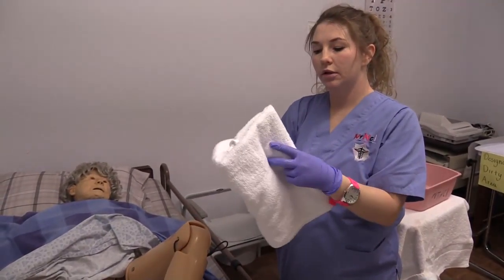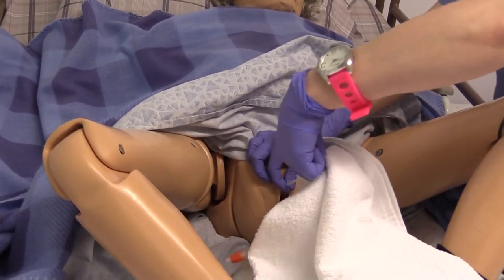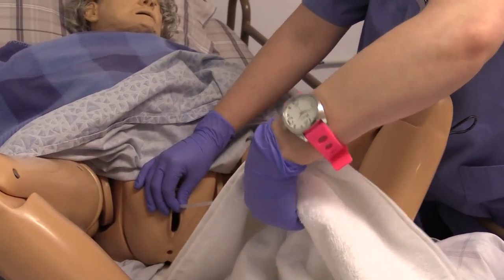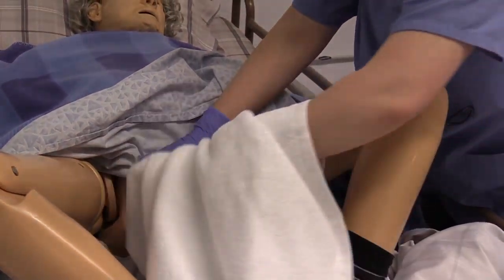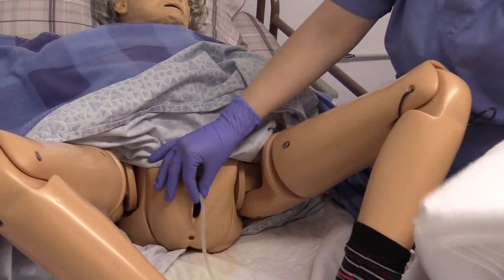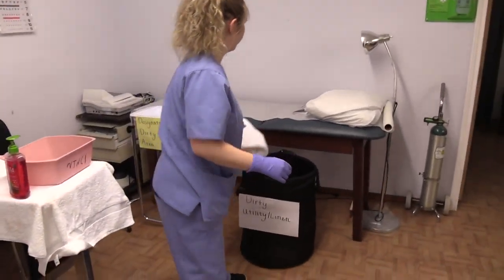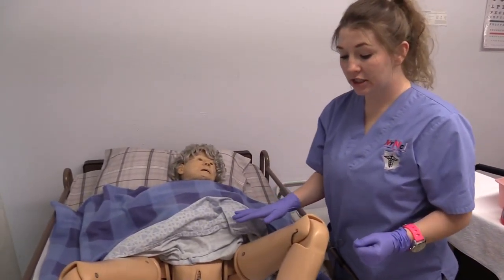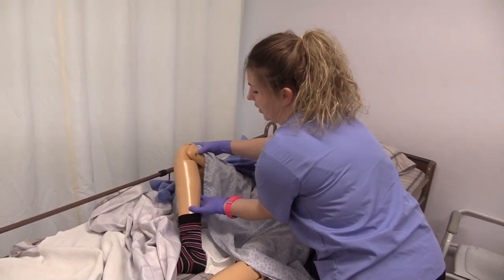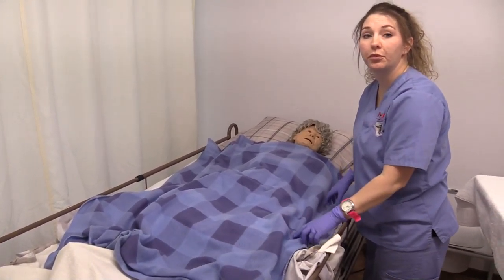Then you're going to take a dry towel, using different parts of it to dry just like we did with the washcloth — holding at the meatus and drying at least four inches of the catheter for three passes. Place the towel in the dirty linen area. Now that the catheter is clean, we can go ahead and pull her gown down, relax her knee and her other knee, making sure that she stays covered. Now we are going to remove the pad underneath her.